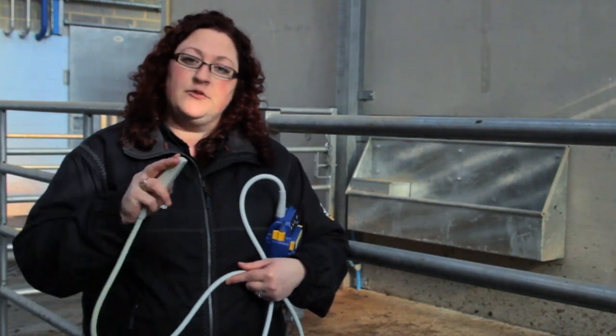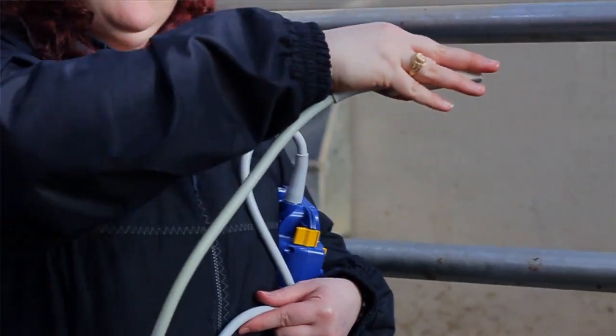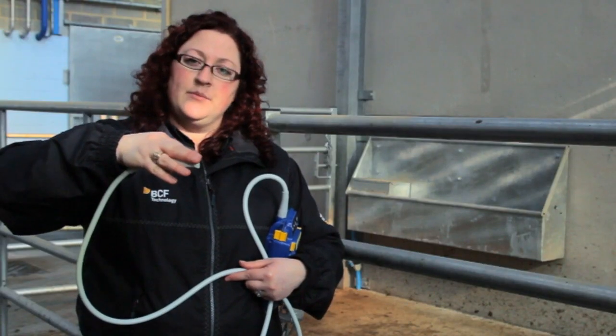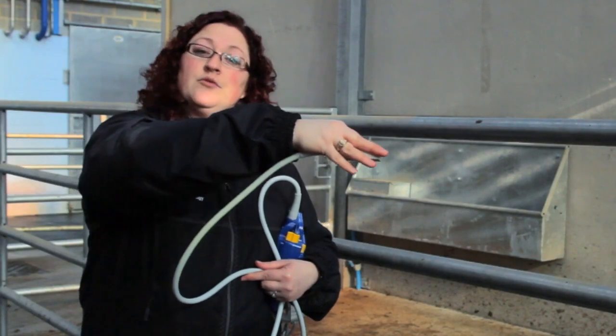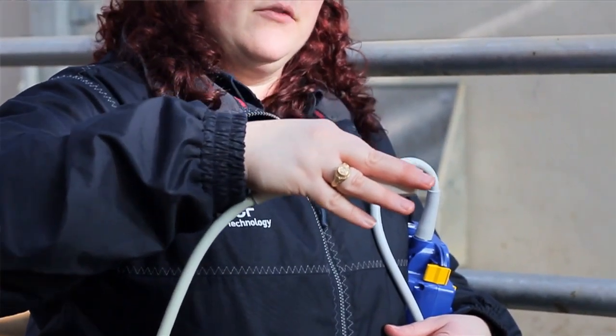There are 4 basic movements that we can do with the probe. The first is we can move forward or back. And that will enable us to go more cranial or towards the head of the cow, or further back towards the cervix.